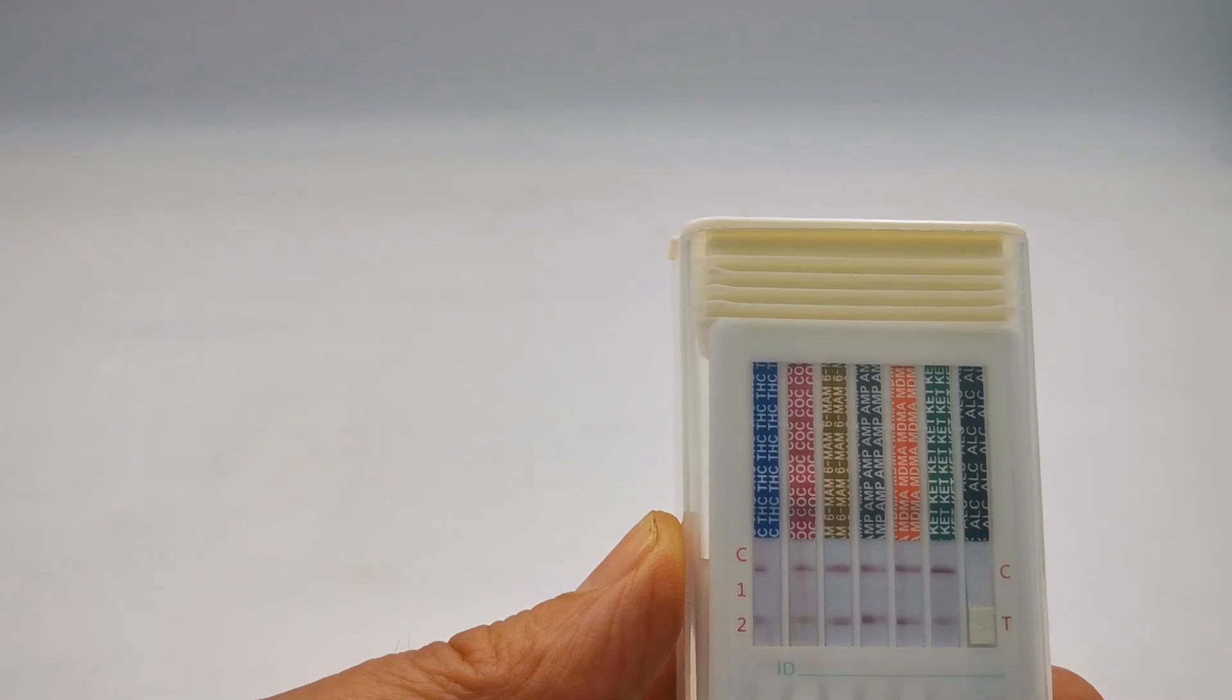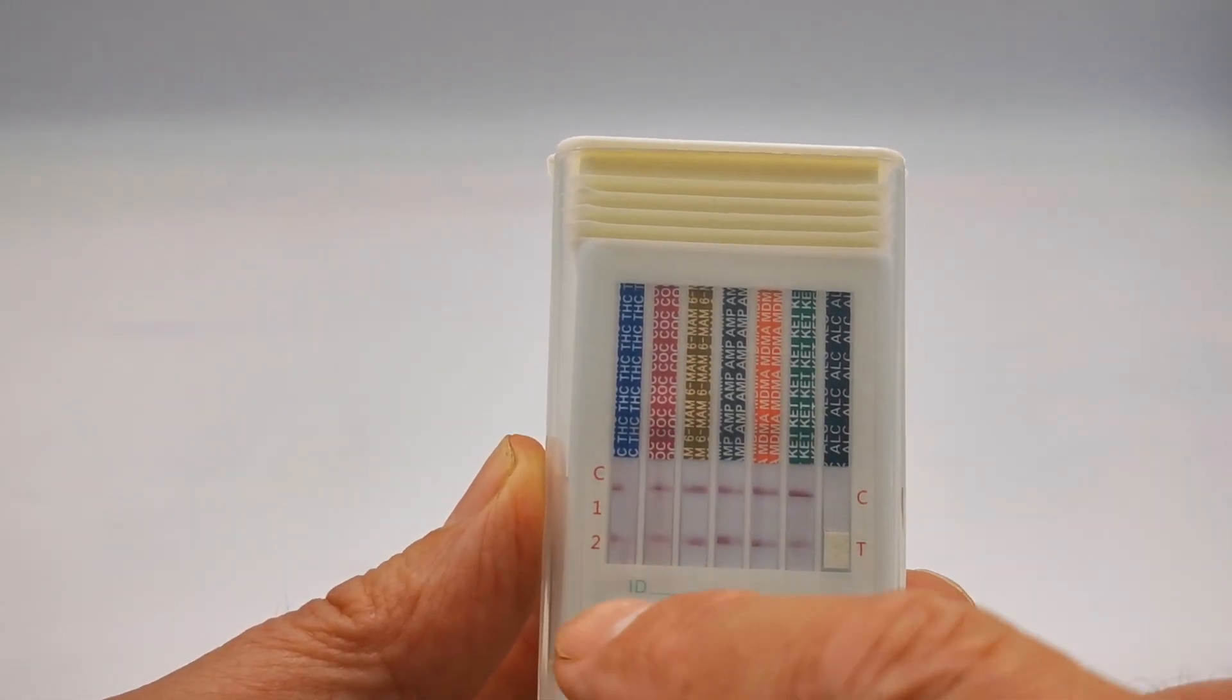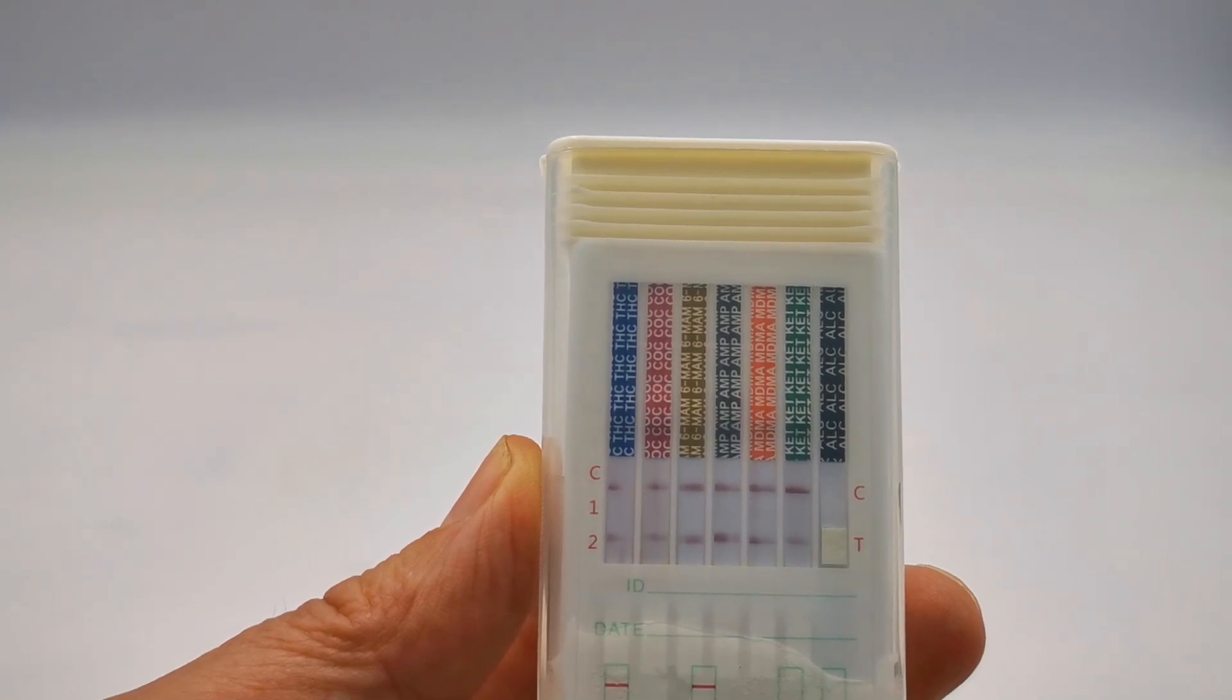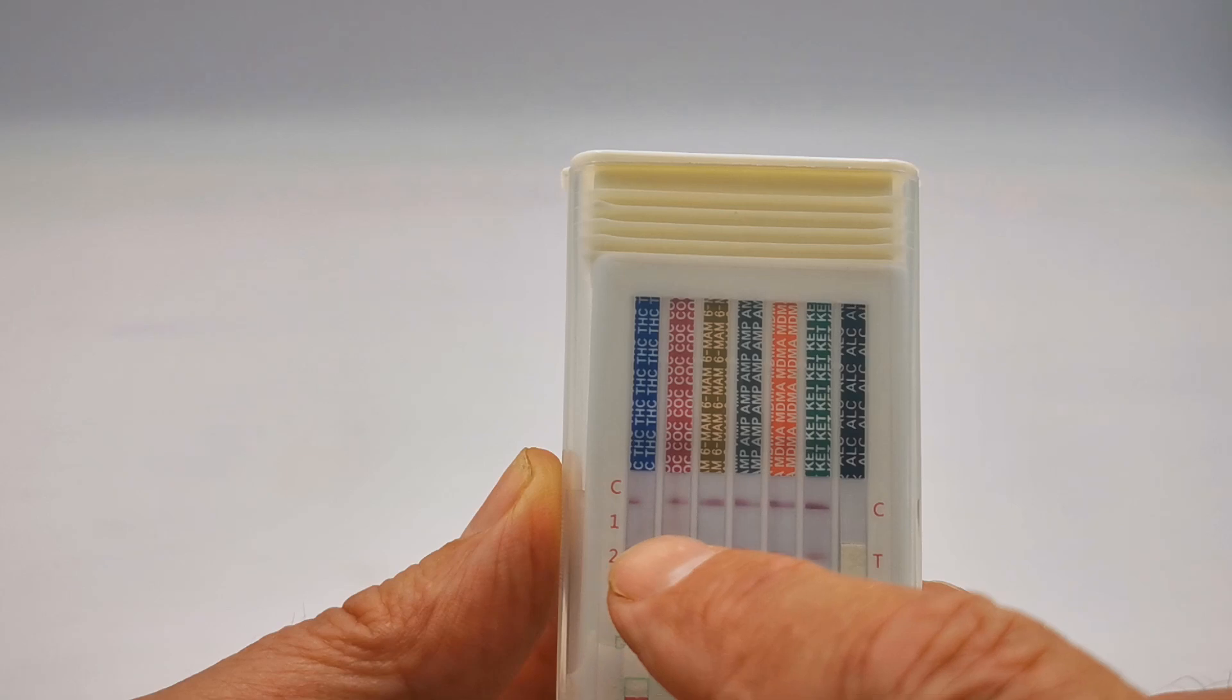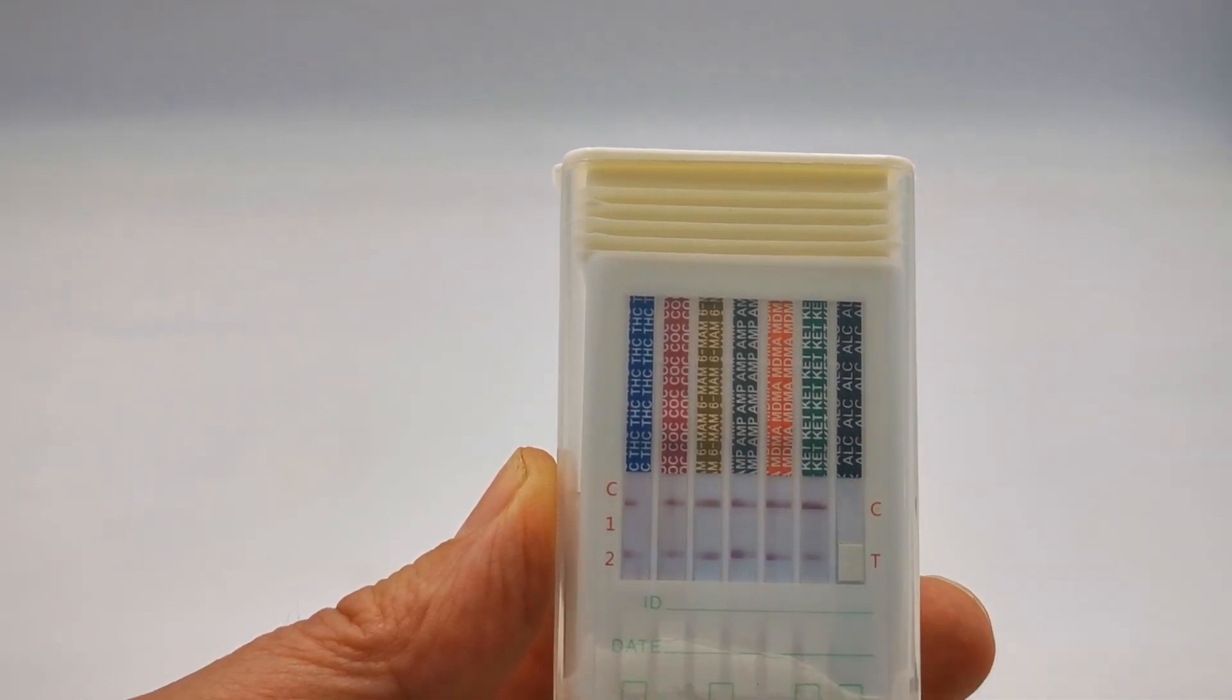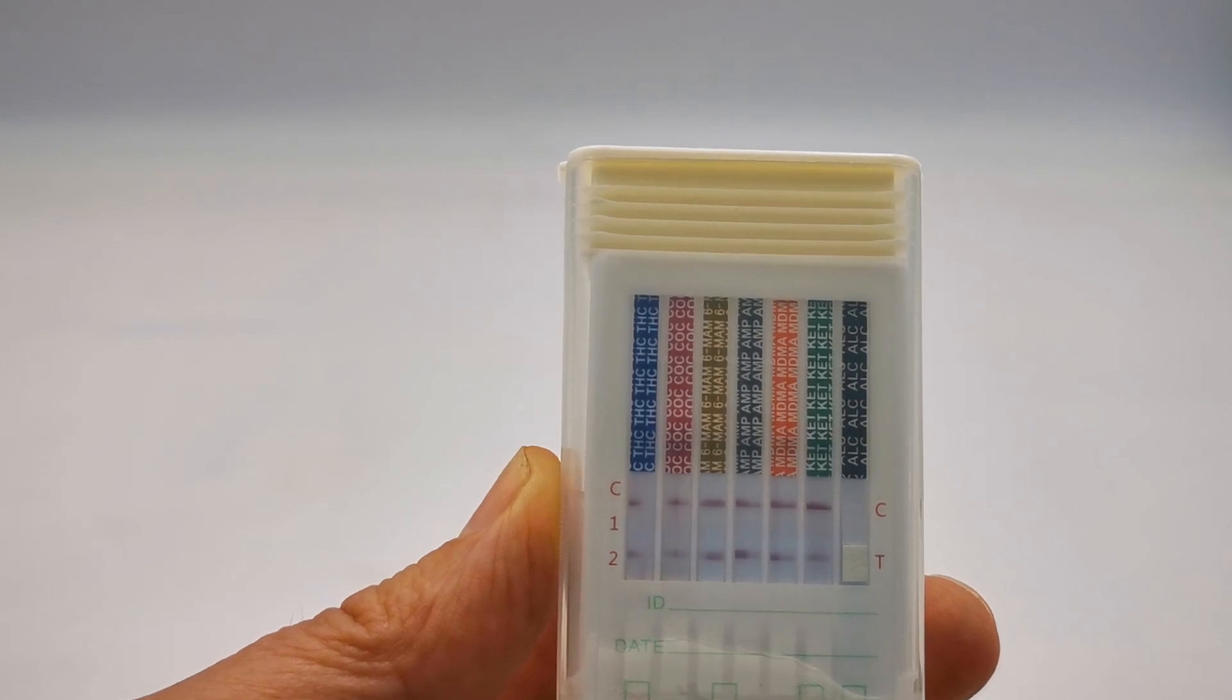All six of the drug tests have got nice control lines across them and all six have got test lines indicating negative results. If we had a positive result, we would have a control line but the complete absence of a test line showing at eight minutes.